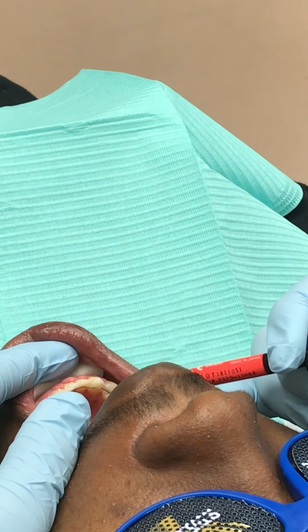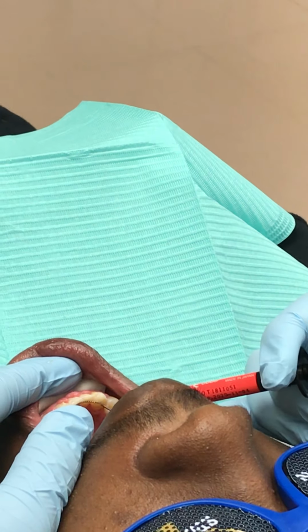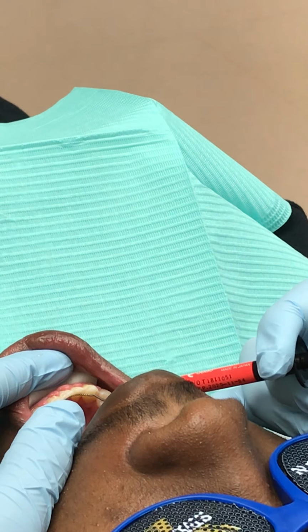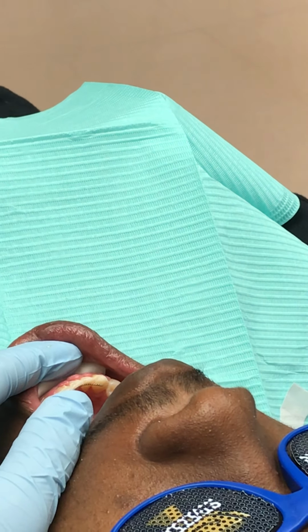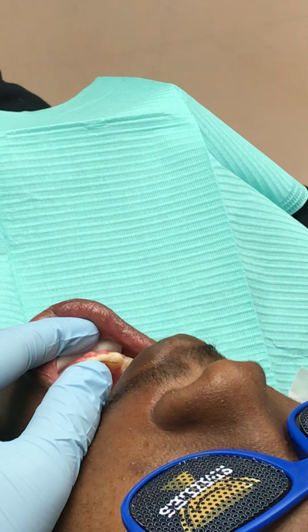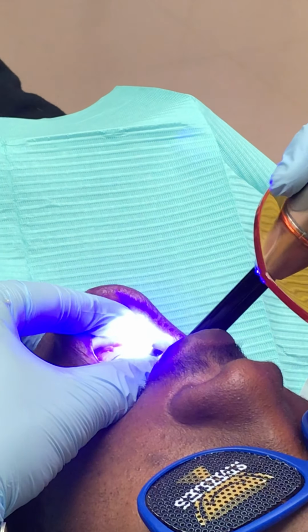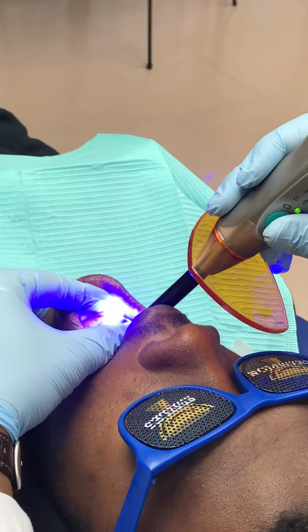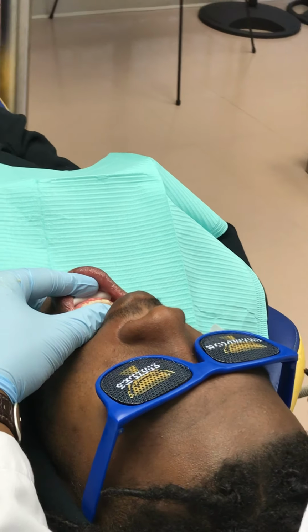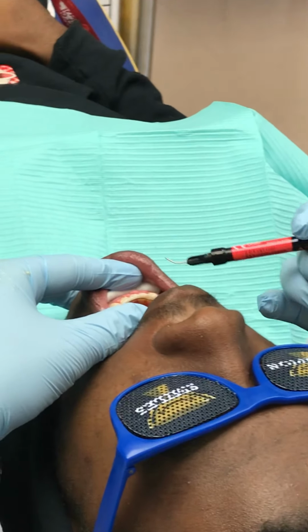Okay, so again, it's a 3-step process, and the goal is to create a nice, fluid, complete coverage of adhesive without any voids. As long as it's smooth, then it's comfortable to the patient. When it's comfortable to the patient, the longer it will last, the better they'll take care of it, which means the better job it's going to do from a retention standpoint. I should say the better it's going to do its job.